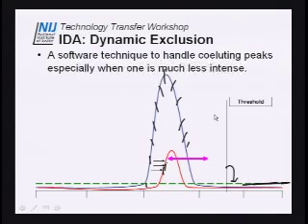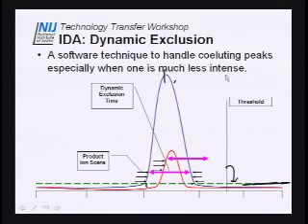But once I've seen alprazolam 3 times, I want to start ignoring it. So if I had another compound buried under here, I might actually start seeing it. Okay? And what will often happen is on the very tail side of the peak, after my dynamic exclusion for carisoprodol has ended at 15 seconds up, it's now fair game again, and I will actually begin to see it again 3 times. Make sense? That's dynamic exclusion. And that's the whole thing in a nutshell right there.